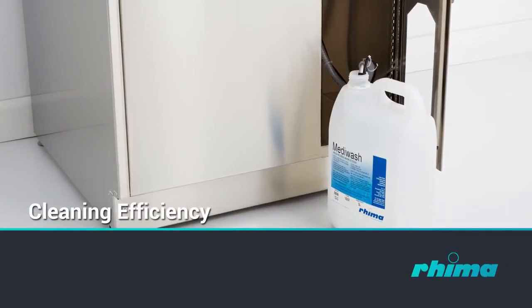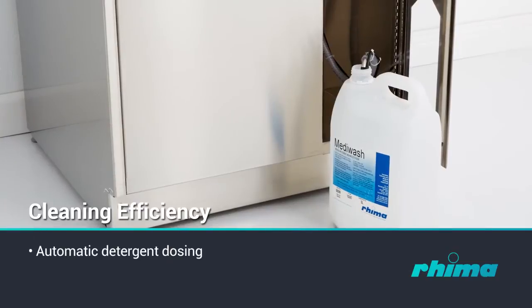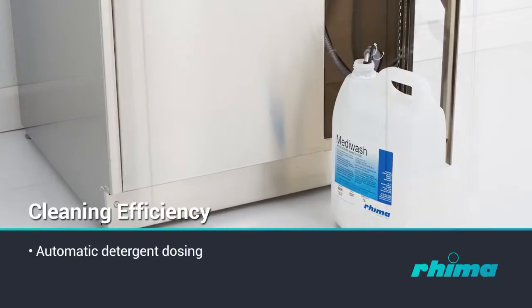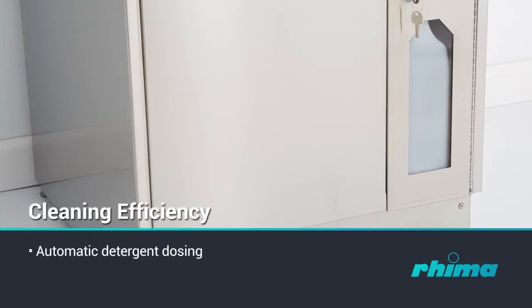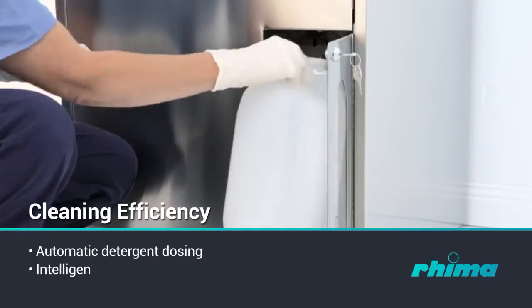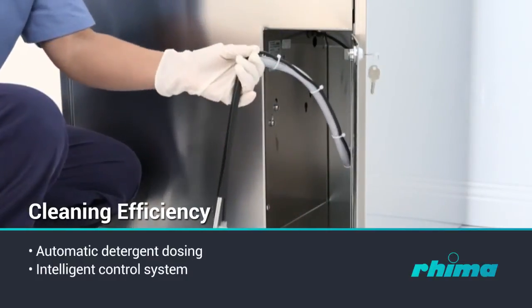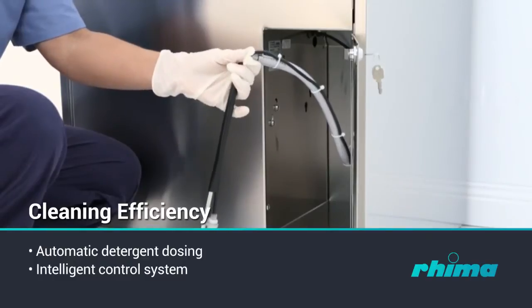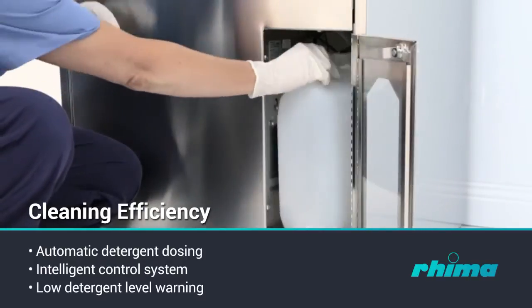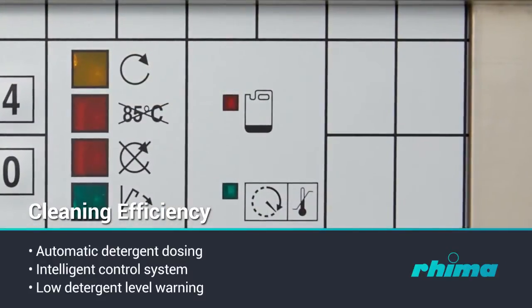Cleaning efficiency is increased by automatically dosing the precise volume of detergent at the correct time of the wash cycle. The detergent container is safely positioned into the easily accessible housing. The intelligent control system monitors the washing pressure constantly and secures the achievement of the preset process values. A low-level detecting system will illuminate the red indicator to warn when the detergent volume is running low.